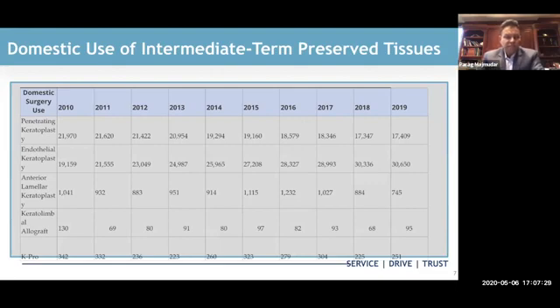It's kind of a busy slide, but if you focus on the first two rows, if you look in 2010, there were 19,000 endothelial keratoplasties done, and the majority of them were DSEK. And look at 2018 and 2019, you can see that there are now more than 30,000 procedures being done. And these are a combination of DMEK and DSEK. All the while, you can look at that first row where penetrating keratoplasty numbers are decreasing steadily as well, as we're shifting some of these endothelial dystrophy patients from penetrating keratoplasty to lamellar techniques.